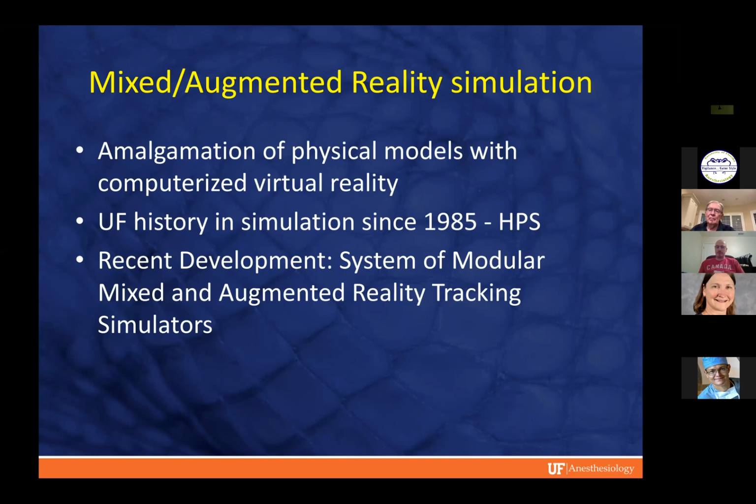And that's sort of the degree to which they interact, which separates mixed reality from augmented reality. For the purpose of this talk, the terminology really doesn't matter a lot. But what we're talking about is simulation tools that can allow us to explore a physical object that doesn't have to contain 100% of the physical elements we might want to play with in terms of simulation, that we can build some of that just into a computer exercise.